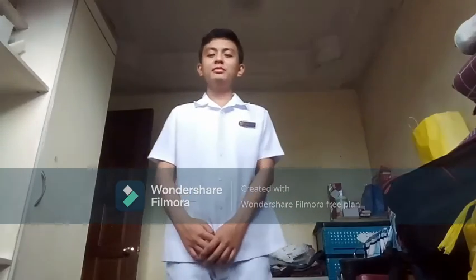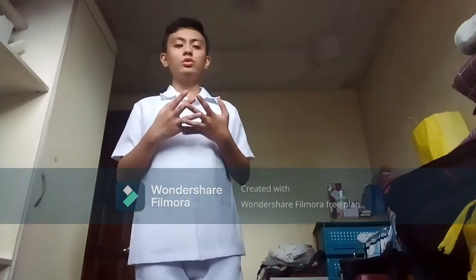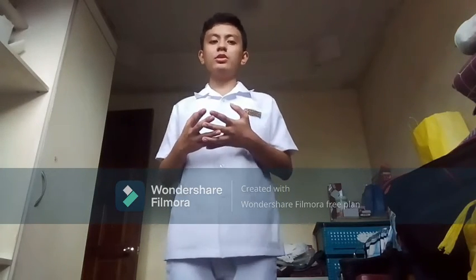I am Prince John Baoy, a second-year nursing student, and I will be performing this video for catheterization for female patients. So the first thing to do is an assessment of the overall condition, which includes her consciousness and ability to participate in the procedure.